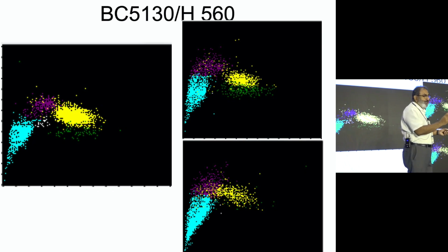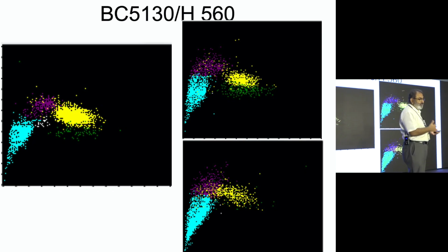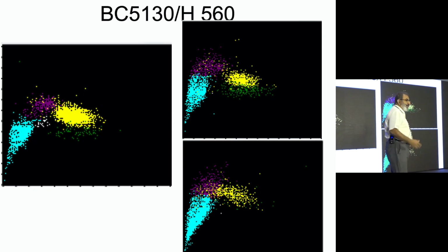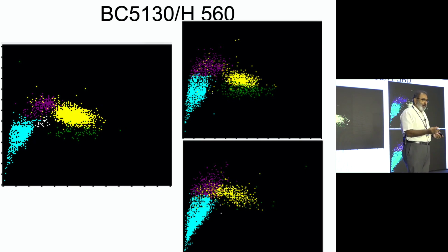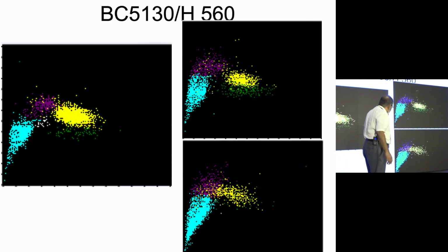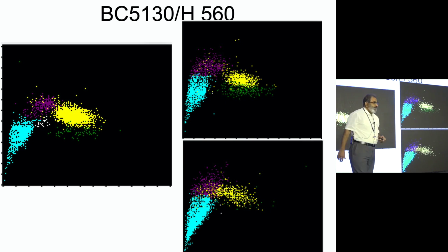So BC 5130, simple cell counter. And my student, one village girl from Vellore, says that it looks like an inverted love. So you see this? An inverted love in dengue. That's because of some of the lymphocytes which undergo changes. Yeah, correct.